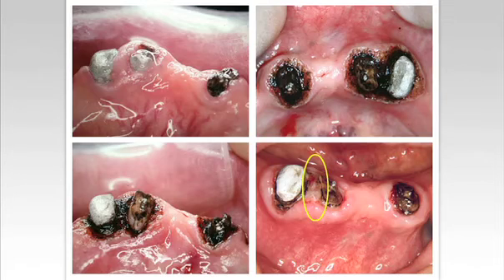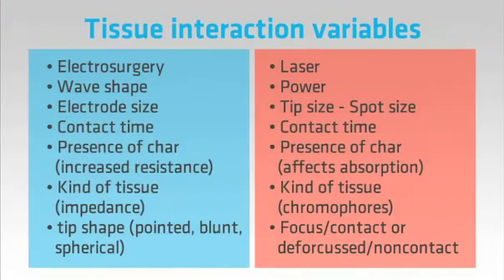In the 1-week post-op review, shown in the lower right, you can see how well all the tissues have healed, except the area where I used the laser to create that intentional heat damage. Hopefully you will never need to use this technique tip in your practice, but it's good to have in your pocket nonetheless. Let's now summarize some of the key points we have learnt and compare the diode laser to electrosurgery.